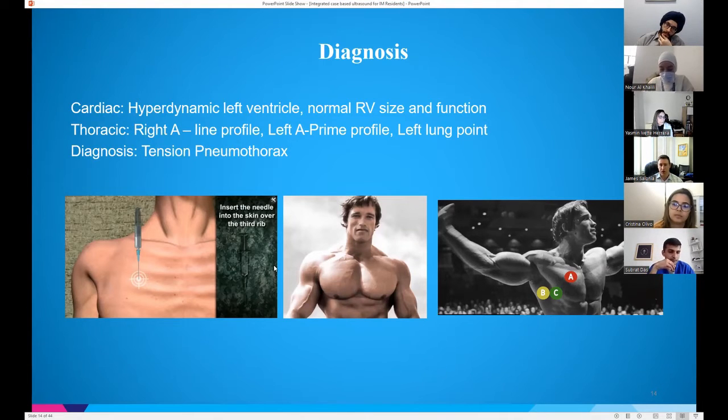So usually when you have a tension pneumothorax, anywhere in the second intercostal space up into the mid-axillary line will be beneficial. And the ED literature has actually looked at this. So remember, if somebody's coming in, and more likely at our hospital setting, you're not going to get somebody who's just got gigantic pecs, but just morbidly obese, right? So that's what we typically see here. You got to find other areas where you can stick the needle, and really you can find it in the mid-axillary if you need to.